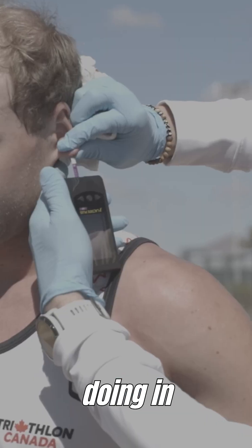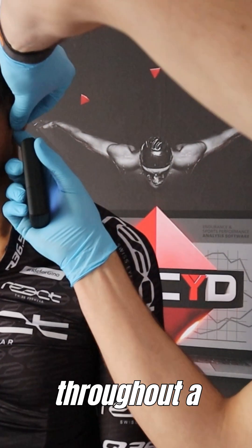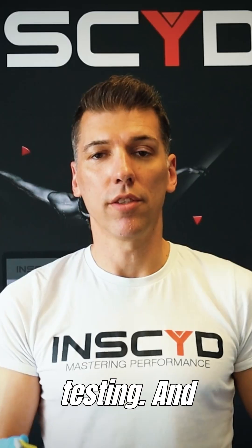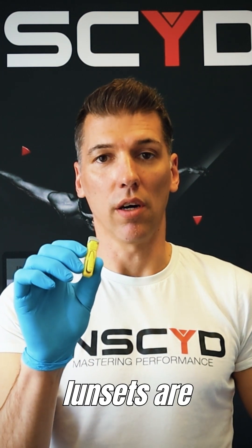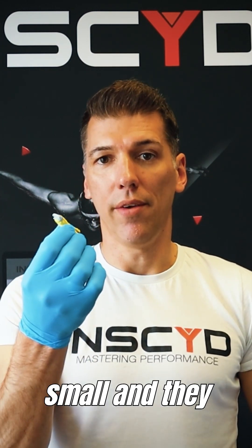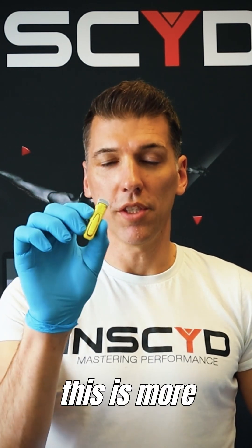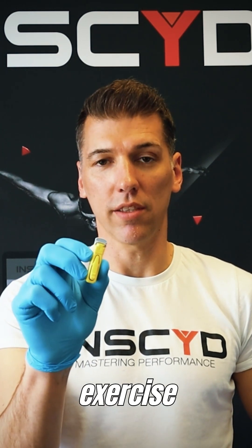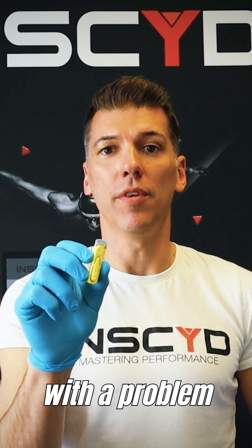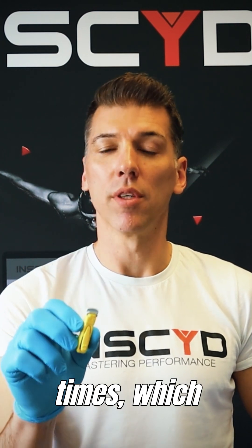The difference with exercise testing is that you need several lactate samples throughout a whole exercise performance test. The opening in the skin that these automatic lancet sets create is relatively small, and they have a very small needle, since they're designed for one-time use on the finger. If you use those for lactate testing in exercise physiology, you'll likely end up having to prick your athlete or client several times, which is really uncomfortable and disturbs the workflow.